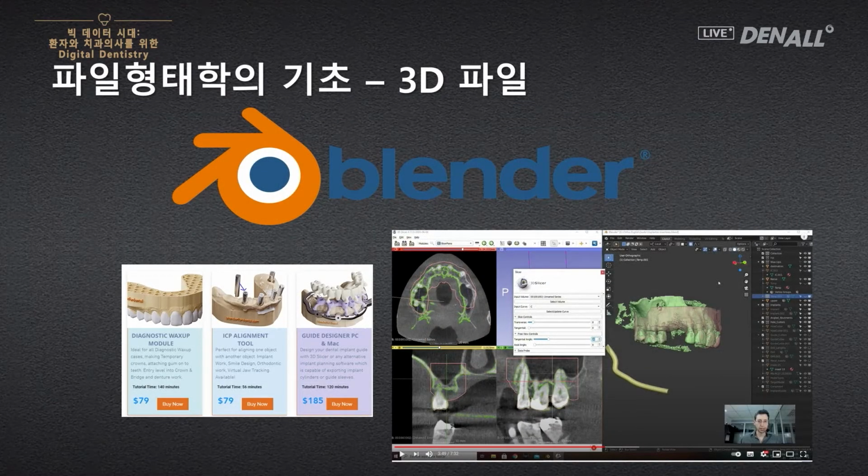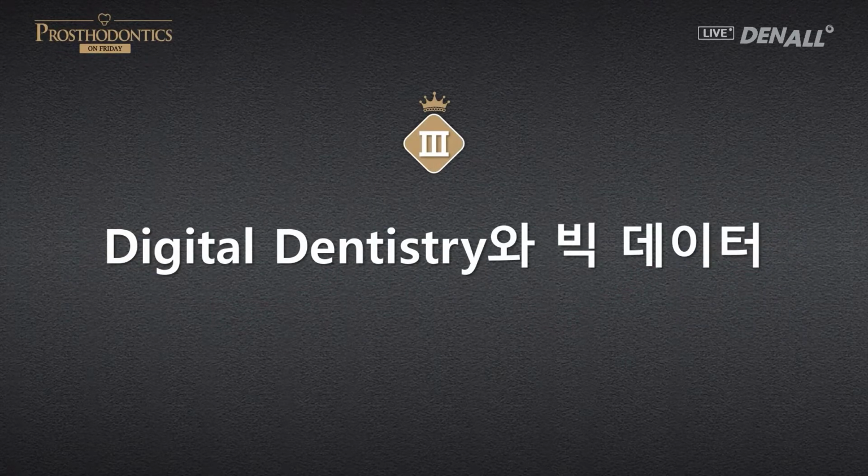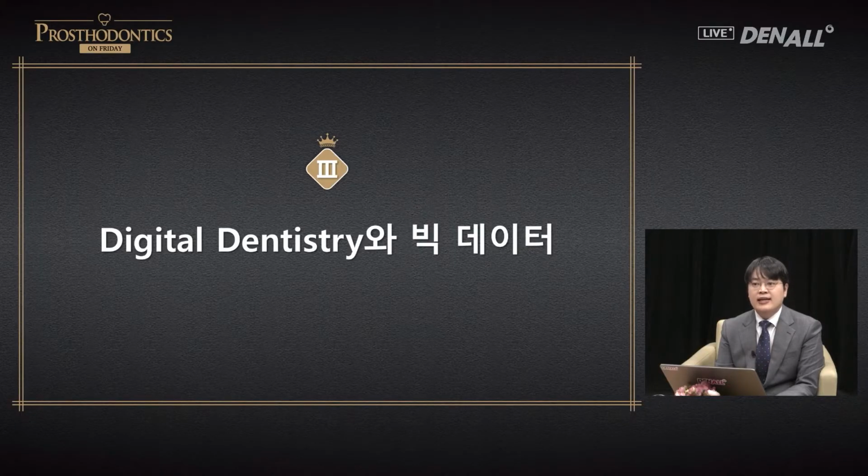A disadvantage of an open source program is that it takes a long time to learn the program compared to a commercial one. These programs are well-known commercial CAD programs. Currently in dentistry, these programs are used to change the vertices in the 3D programs to do the digital work. Digital dentistry is advancing quite rapidly, combining AI and image processing technologies to make it very easy for practitioners to use. A lot of technologies are converged with dental technology.